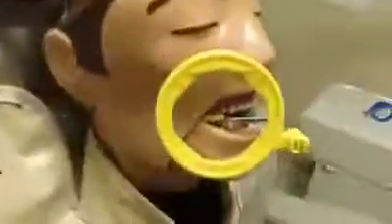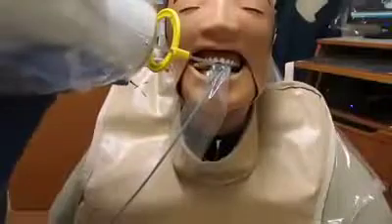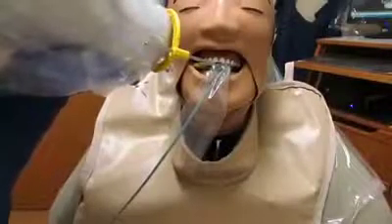Begin with the molar exposure by placing the receptor at the center of second molar. Have the patient bite down and align the PID with the ring. Then expose the receptor. For the premolar exposure, move the receptor slightly to the front by placing it at the middle of the first maxillary premolar. Align the PID and expose the receptor.